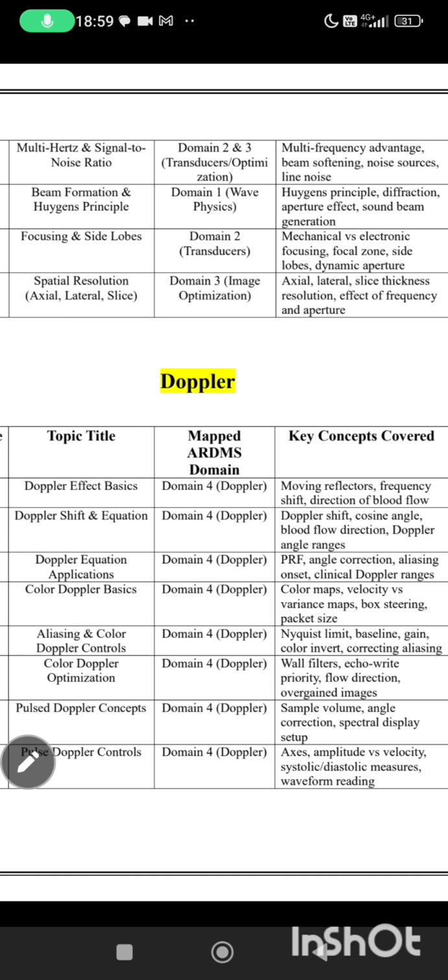Okay, then in pulse wave Doppler, systole and diastole. When is the magnitude of the Doppler shift high and when is it low? It is high in systole because we can see the peak, and magnitude is displayed along the y-axis. Magnitude is low in diastole.